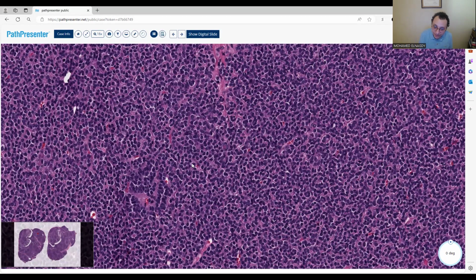This is metanephric adenoma. What's the other tumor which is associated with BRAF mutation? So this is metanephric adenoma or mesonephric? I don't know. Yeah, this is metanephric adenoma, so it's going to be the metanephric stromal or mesonephric stromal tumor, whatever. Yeah, no, let's go back to that in the presentation.